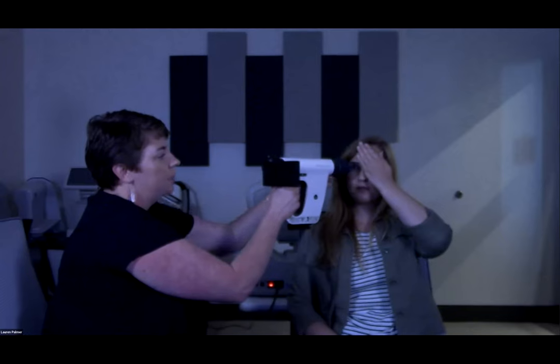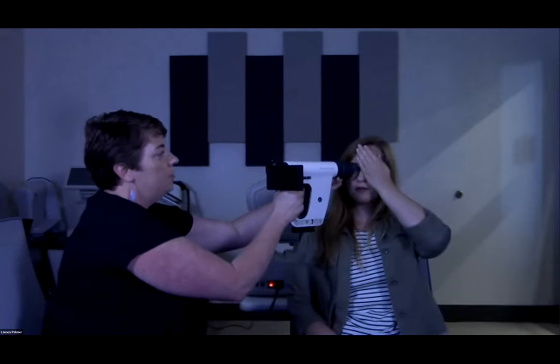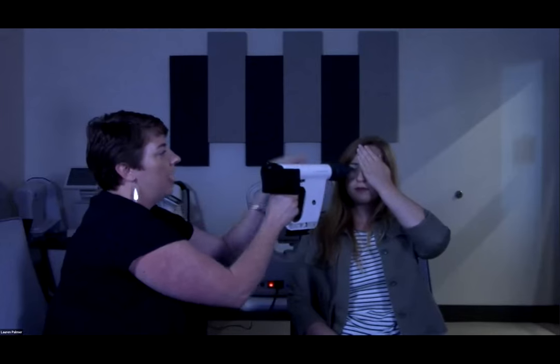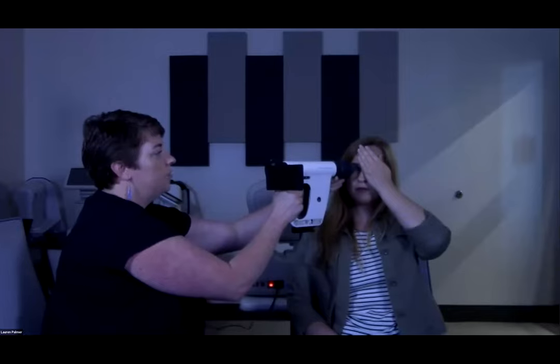You can look at the image capture screen to visualize the patient's eye in your field of view. And then you just want to press the device toward their eye and you want to keep it parallel with the floor. And again, you can use your thumb to pivot left and right or up and down to make sure that you're lined up properly. And so there's kind of a sweet spot that you're looking to hit where the retina fills the screen and all the shadows go away, and then you can capture the image.